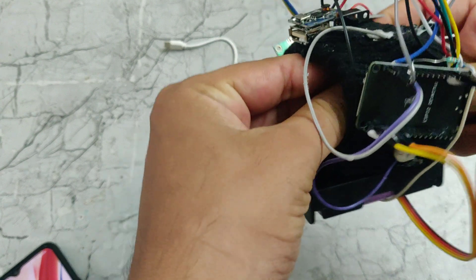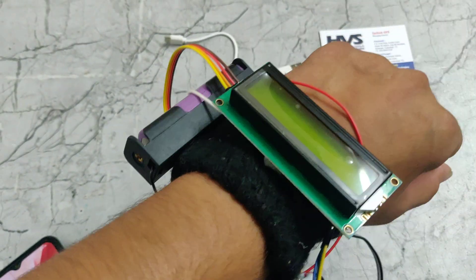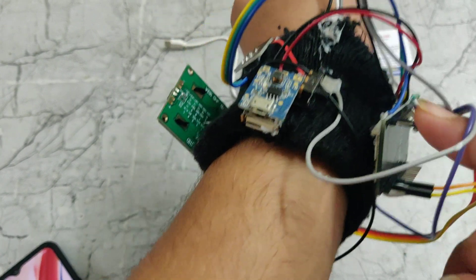We need to place this sensor on our hand like this. Now I have placed it on my hand. Now we need to turn on the power supply using this switch.